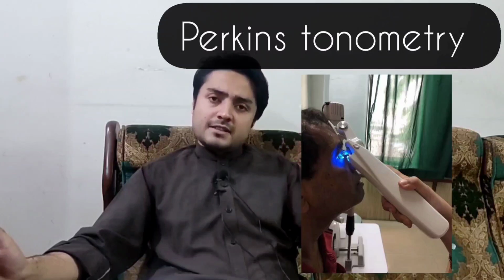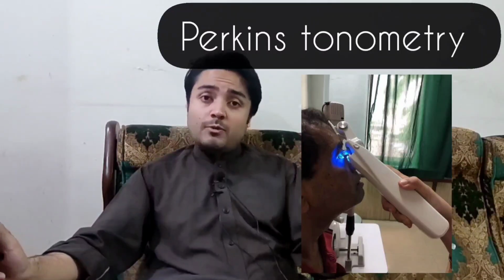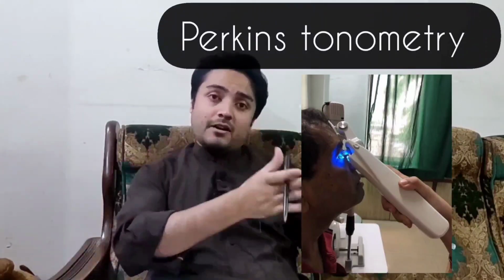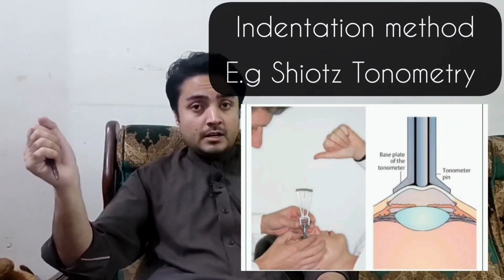Perkins also has the same principle as Goldmann, but the thing is, the Perkins tonometer is mobile, you can take it with you anywhere, while the Goldmann applanation tonometer is usually fitted in the slit lamp, so you cannot take it anywhere you like. And the indentation method, the last one, is Schiotz's tonometer. So let's discuss the Goldmann applanation tonometer.